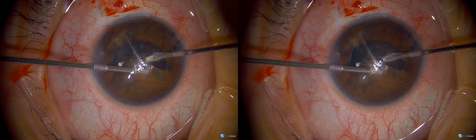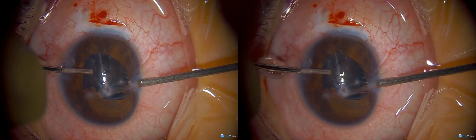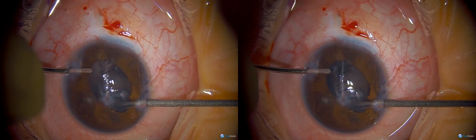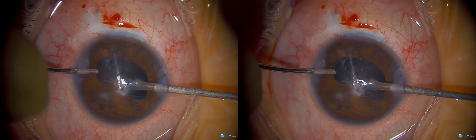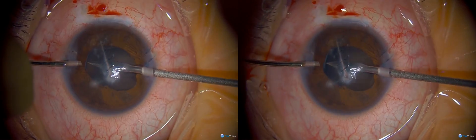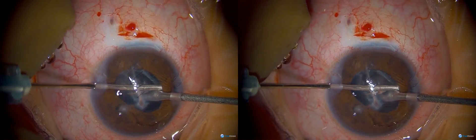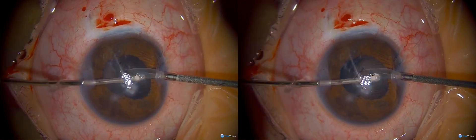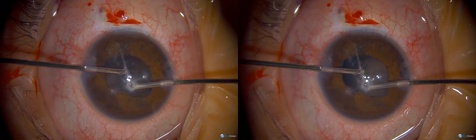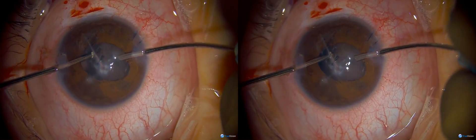Here are some synechiae. If it's tough and you need to cut it, you can put in an MVR blade — I'm just cutting that open; it wasn't breaking so I'm cutting it a little bit. That looks pretty good. After releasing all the synechiae, the iris came together a little bit. That's enough sulcus, so we're good.